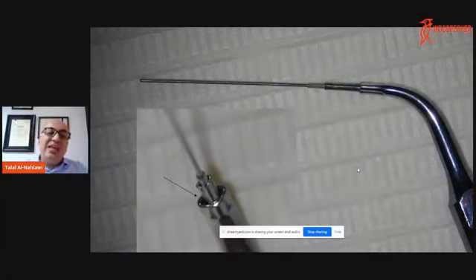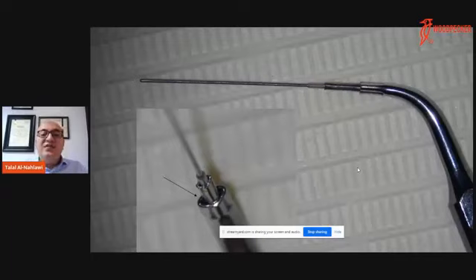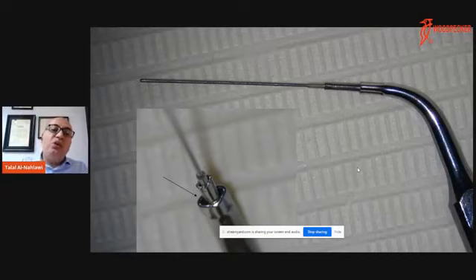Actually, there will be some physical barriers on the walls that have to be removed first. The removal of this dust, this debris, or the remaining gutta-percha on the walls can be achieved with the benefits of active irrigation. When I can add the water flow from the tip of the T2, I can remove most of the debris from the canal. Now I can use the irrigant solution, and after that I can activate it. Because at the end of the day, I don't want to disinfect the debris. I need to remove the debris first by active irrigation, then disinfect the canal using irrigation activation.